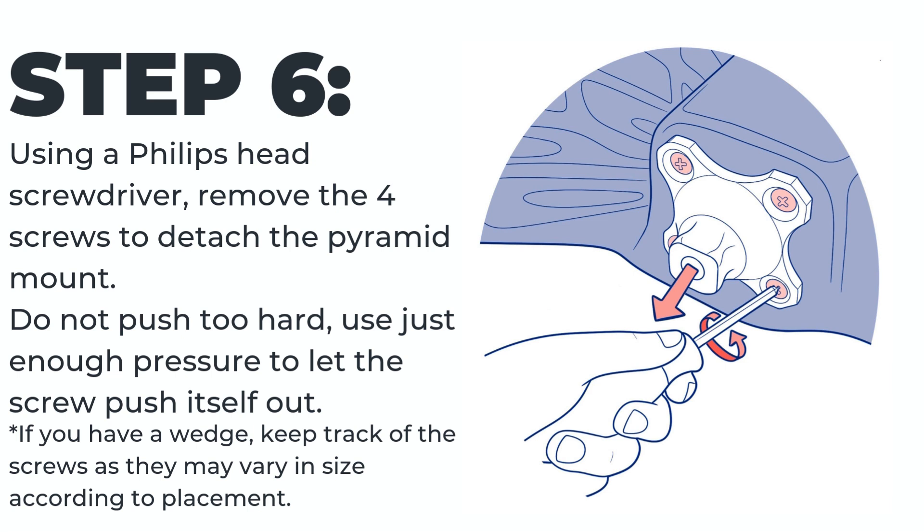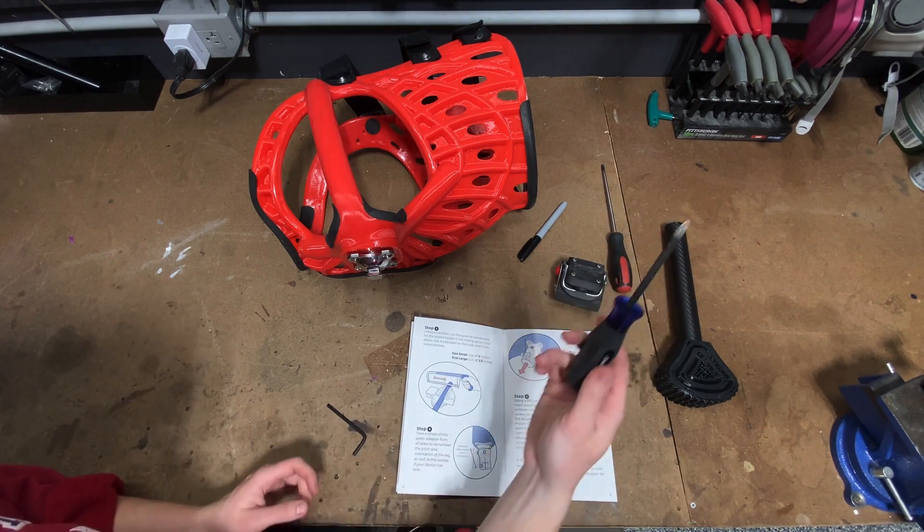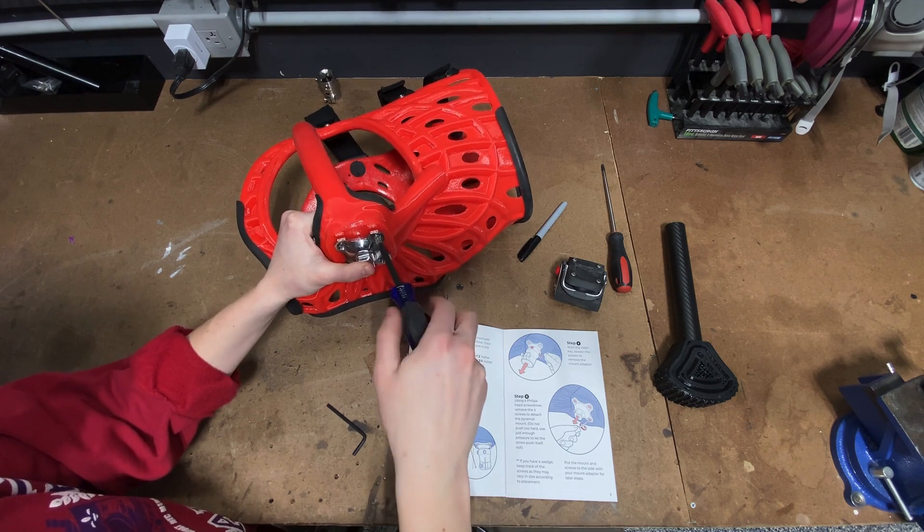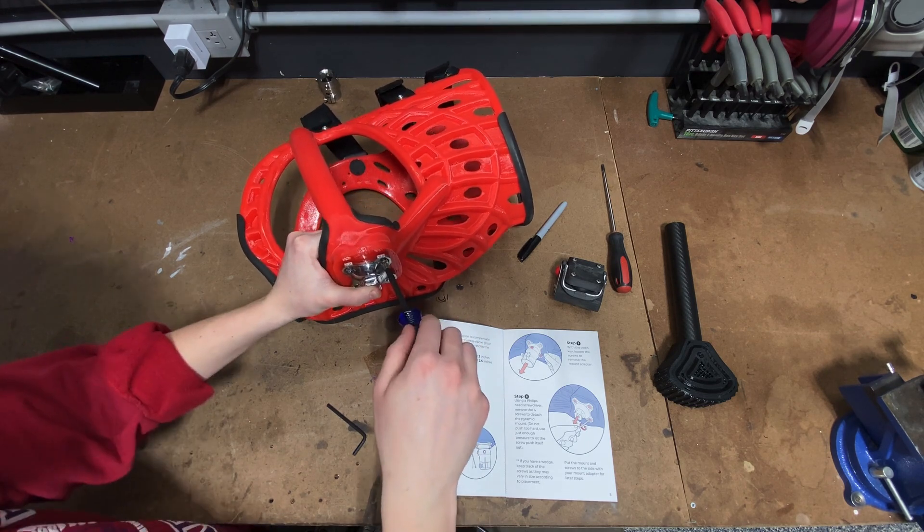Step six: using a Phillips head screwdriver, remove the four screws to detach the pyramid mount. Do not push too hard — use just enough pressure to let the screw push itself out. It may be difficult at first to break the adhesive seal; simply twist the screw back and forth until you can easily back it out. If you have a wedge, keep track of the screws as they may vary in size according to placement. The longer screws will go with the thicker part of the wedge and the shorter with the thinner part of the wedge.